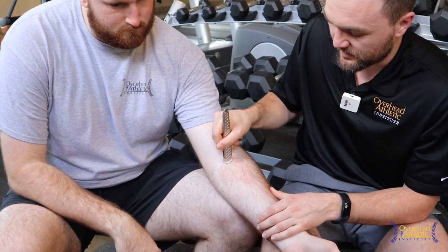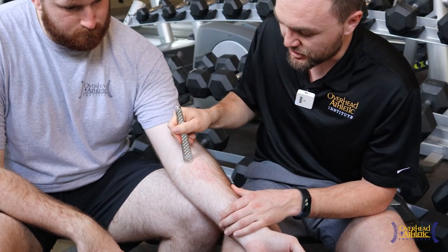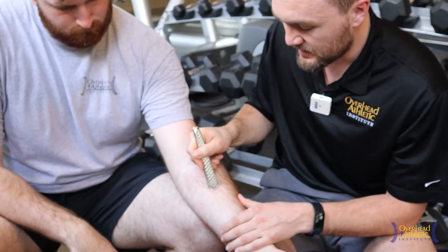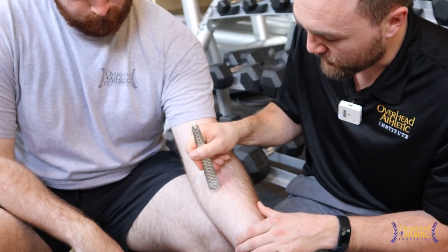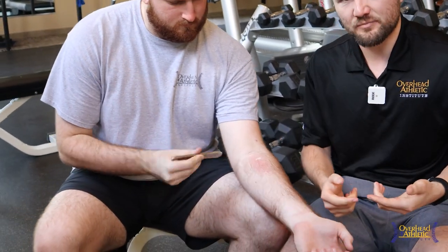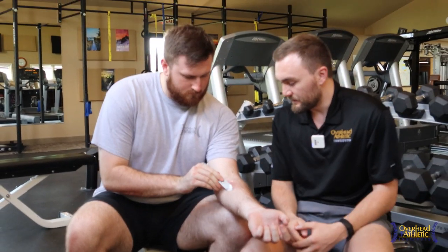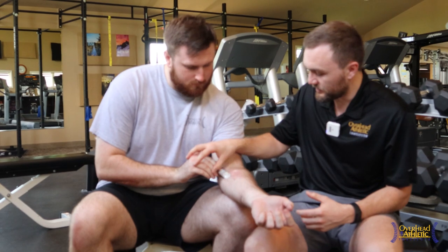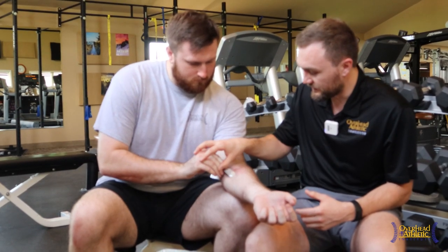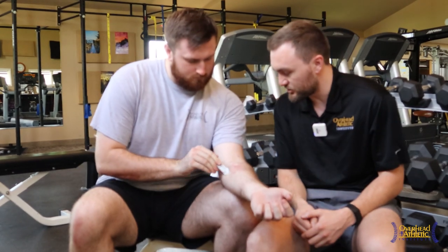You can feel where the muscular tissue is a little more gritty. I can also go to the more sharp or focal edge as I get a little more accustomed to the tissue. I'm going to let Chuck do a little bit of that on his own, because this scraping is something you can start to do at home. Slow down a little bit. Get into the tissue and then pull it back. Good. Now try some quicker, shorter motions.